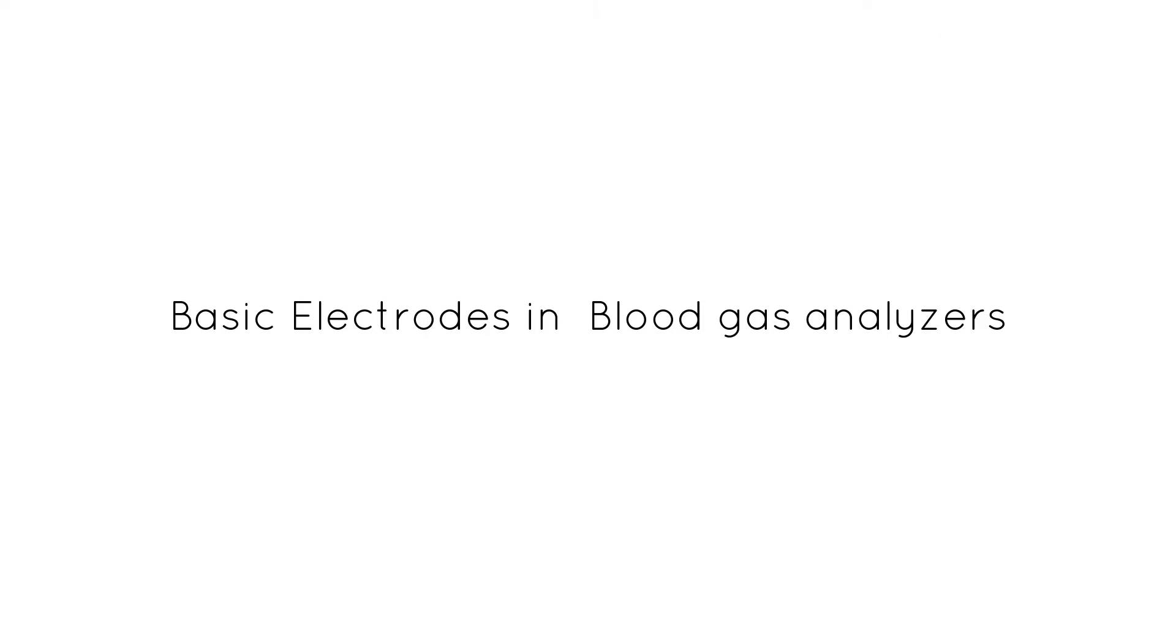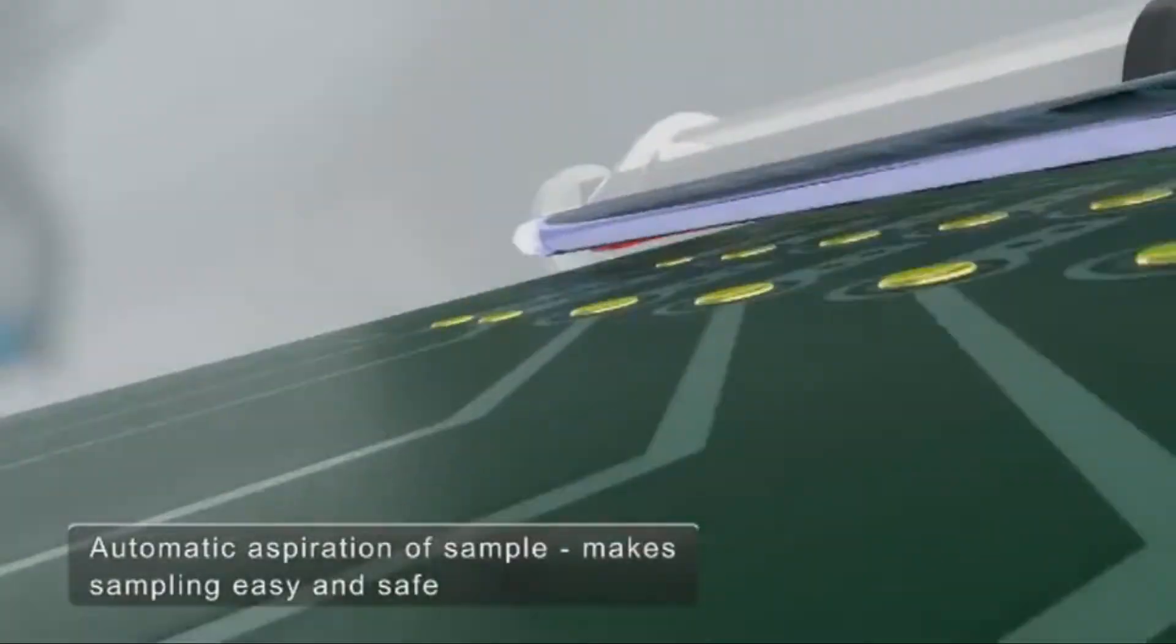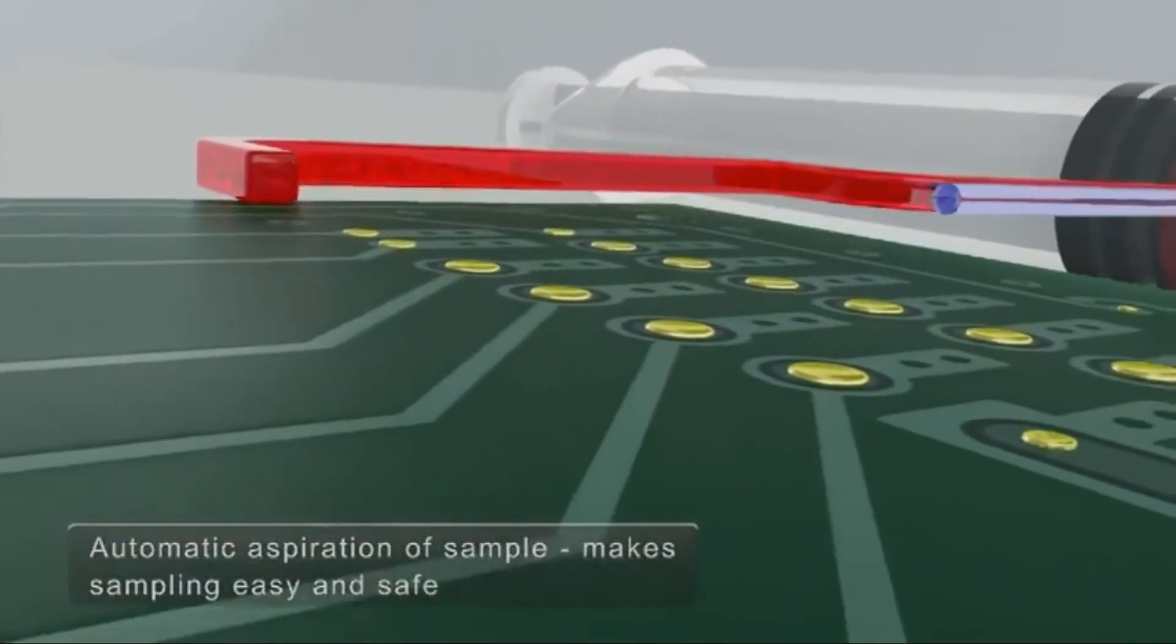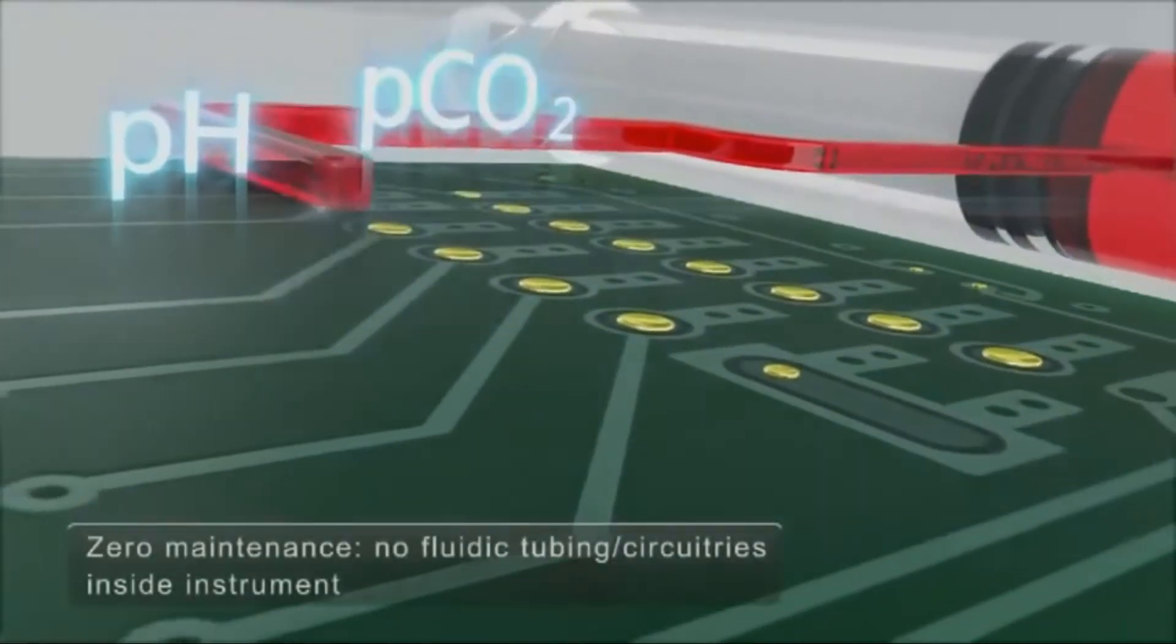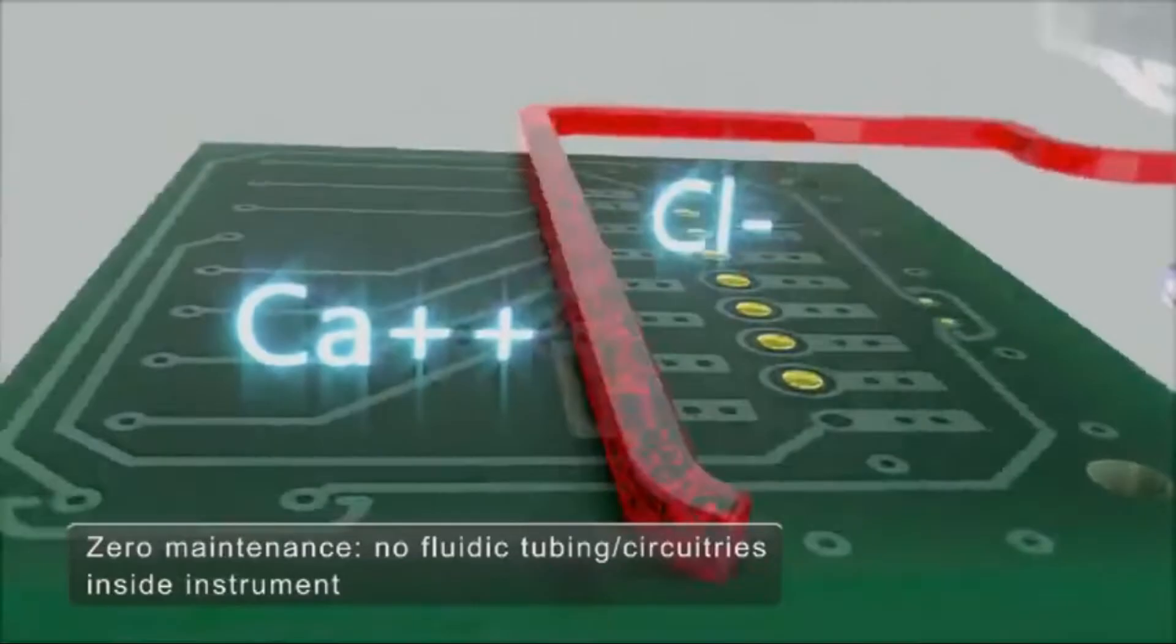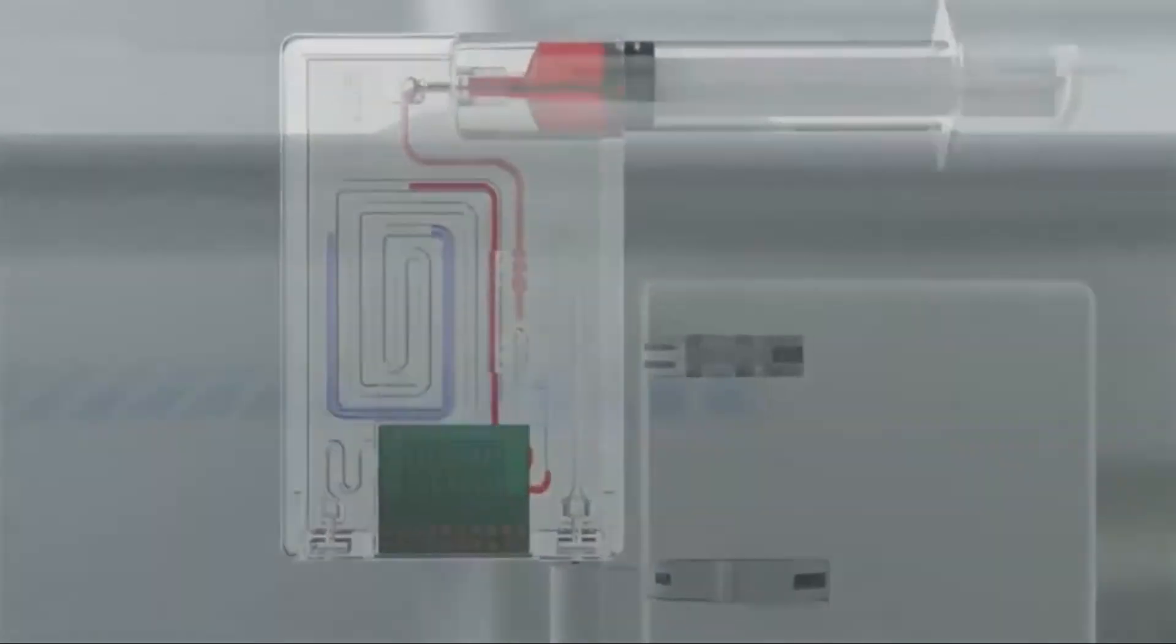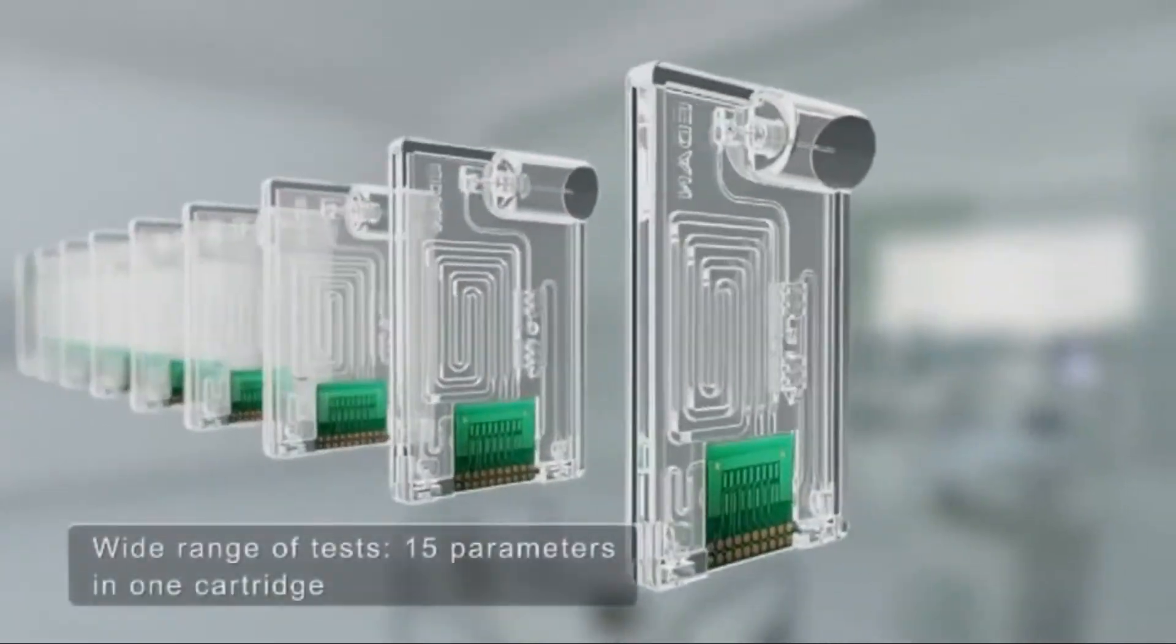Let's learn about the basics of ABG analyzer electrodes. There are many electrodes that have been designed to measure any number of parameters in blood gas analysis. Today, we will look into basic electrodes in this video to understand how the chemistry works in different electrodes.